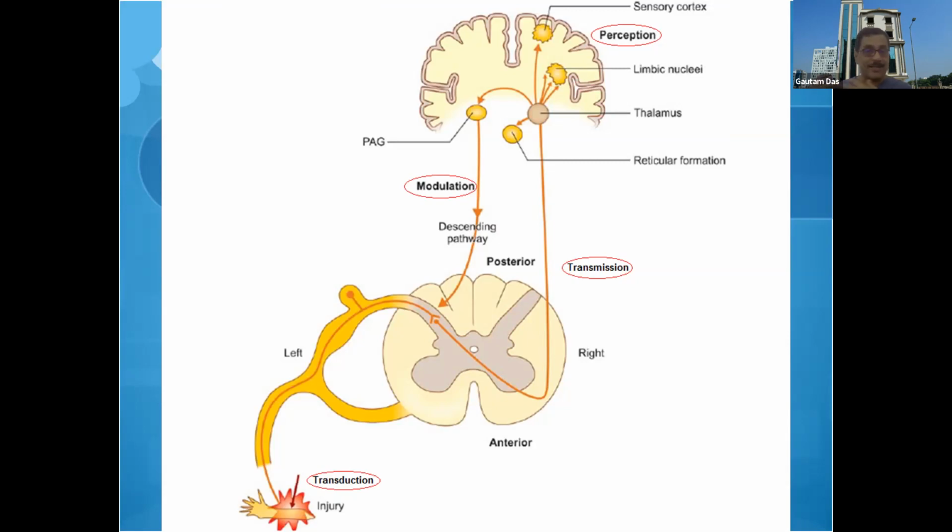So just think of the cardiac pacemaker. There is a pulse generator, or electrical signal generator, a battery, a power generator. It's also called the implantable pulse generator, IPG, and it sends the electrical signal through two electrodes to complete the circuit. Earlier, when Shealy was first implanting, it was basically two electrodes, bipolar. These electrodes were implanted into the epidural space by laminectomy. By laminectomy, they removed the bone and then implanted it.